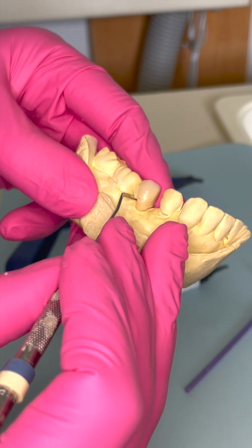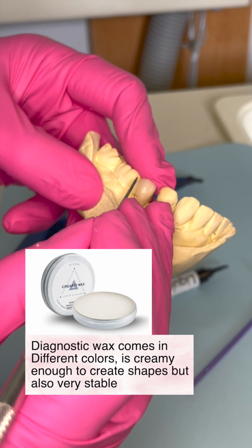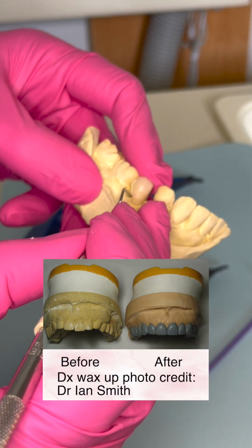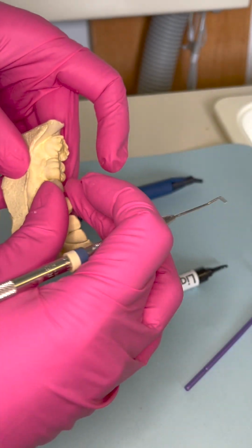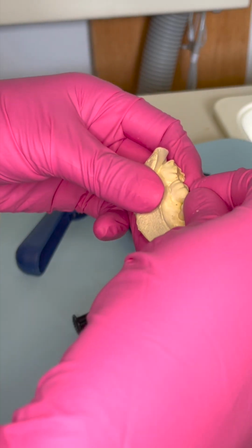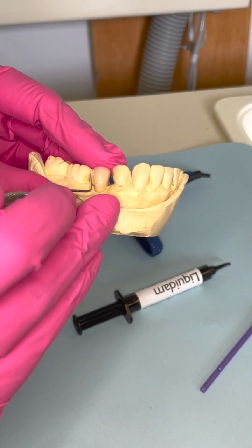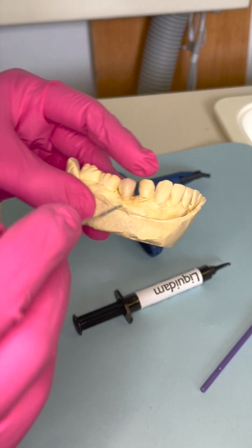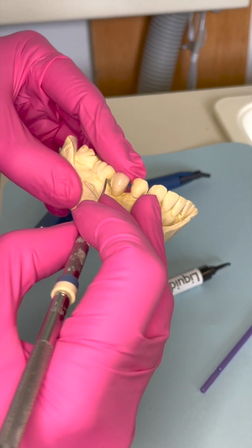Ideally, just for full disclosure here, it's best to do this with diagnostic wax, but we didn't have that in the office. So I'm being creative and showing you guys how you can also be creative in case there's certain things that you don't have in your lab or in your office. You could also, by the way, with this denture tooth, I remember that I had to use an acrylic burr to drill down from the bottom so that it's at somewhat the same height as the other teeth adjacent to it.